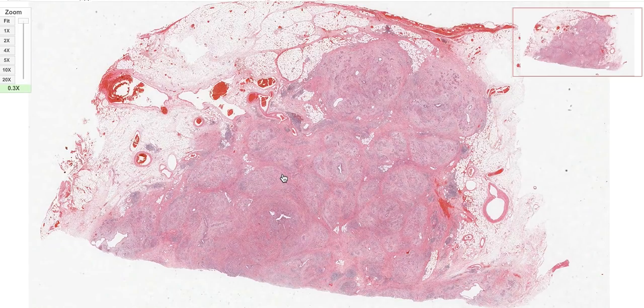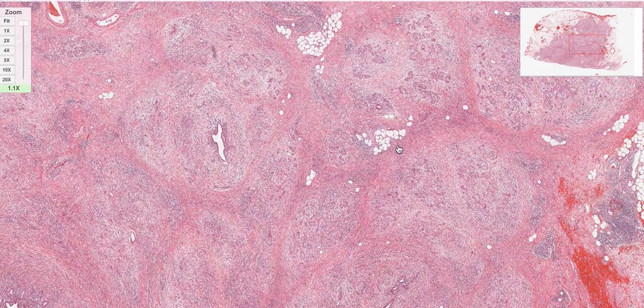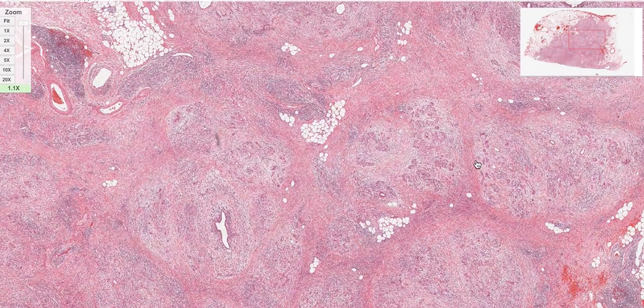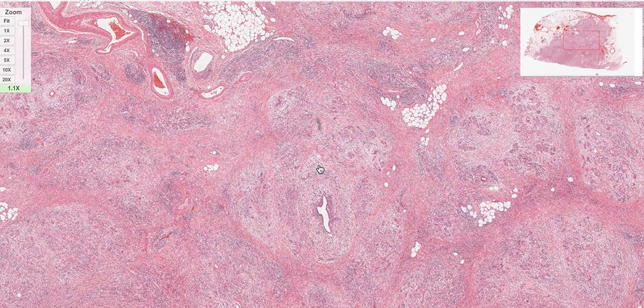We are going to see a similar thing in a liver. The first thought for you is going to be a cirrhosis, a fibrotic nodule, right? So I will imagine that this pancreas is having fibrotic nodules. I'm zooming it up. This pancreas has multiple fibrotic nodules, and these are nothing but the caught up pancreatic glands in between them. First thing.